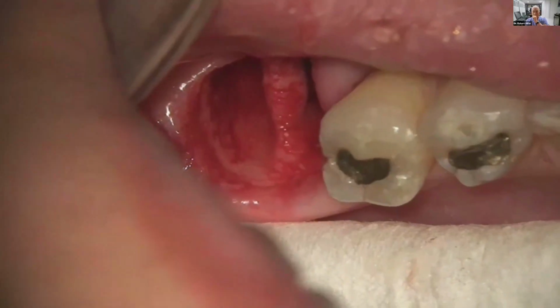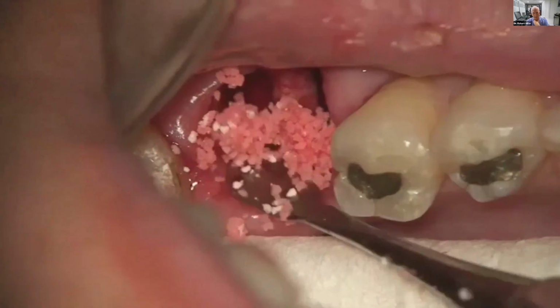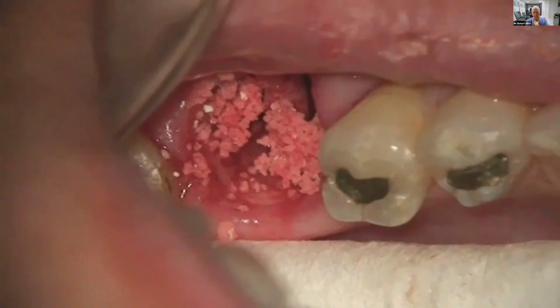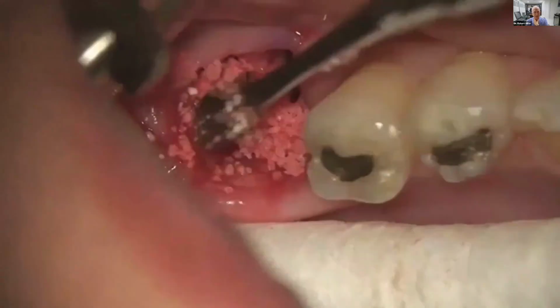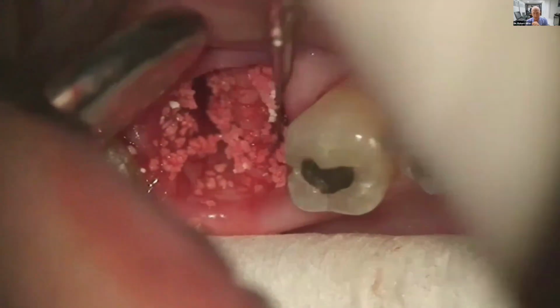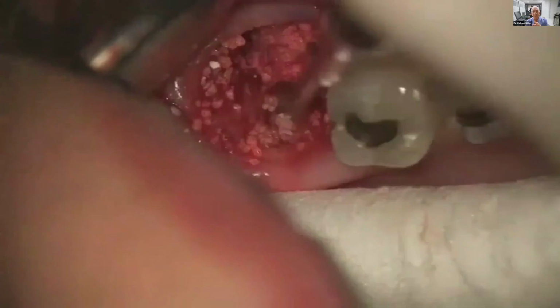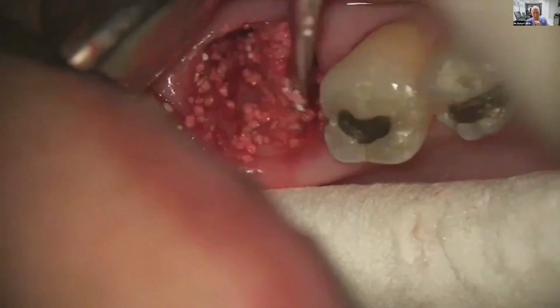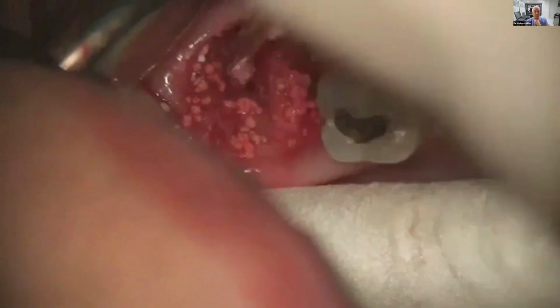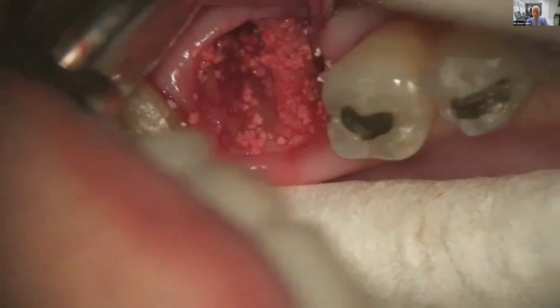So if we look at this, and this is what we did for decades, probably the last 50 years or so. You take a particulate, maybe you put a few drops of venous blood in there. You take the particulate and you start pushing it down into the extraction site defect. You keep adding material again and again and again, pushing it down so there's no gap inside. It gets kind of messy. You have to worry about salivary contamination. And once you fill this up, you can't leave it just the way it is.